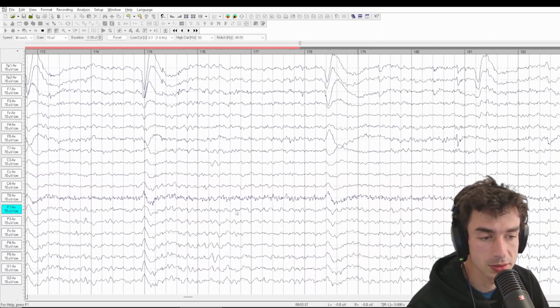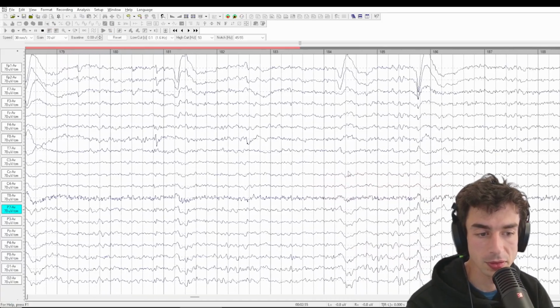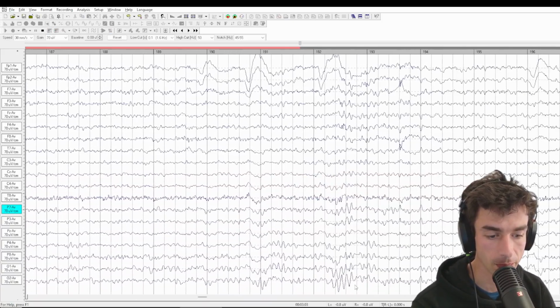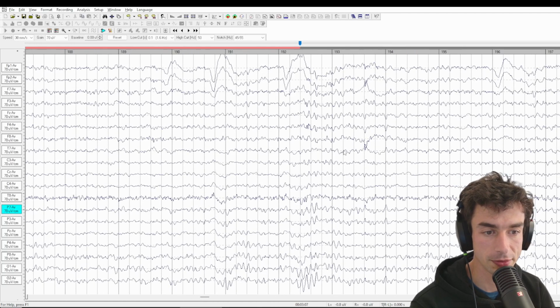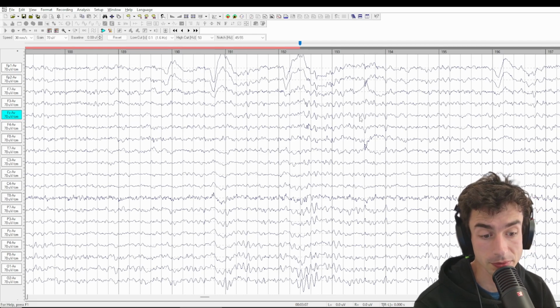More eye blinks. Same sort of low amplitude background activity. And a brief alpha resurgence accompanied by some frontal beta, which is interesting.